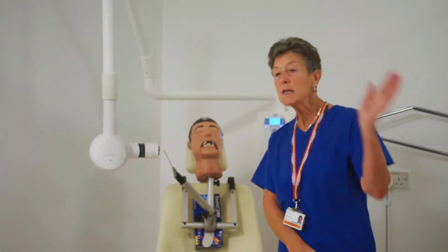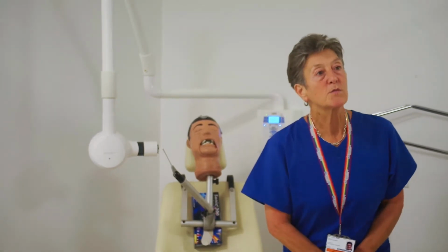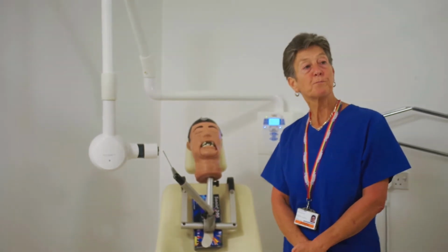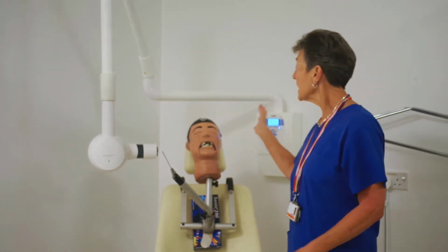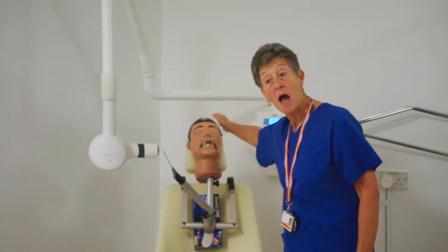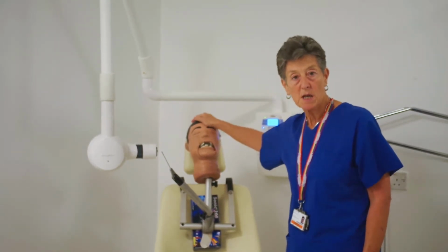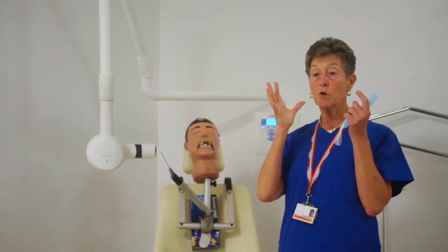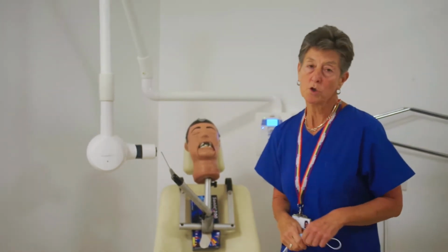Now, my colleagues are standing behind the camera here, so they're going to help me out. Any other ways of reducing the dose of the patient, you two? Patient positioning. Well done. So make sure that your patient has their head against the headrest, so the patient is nice and stable, because sometimes if they haven't got their heads against the headrest, they tend to jerk away from you or could move involuntarily.